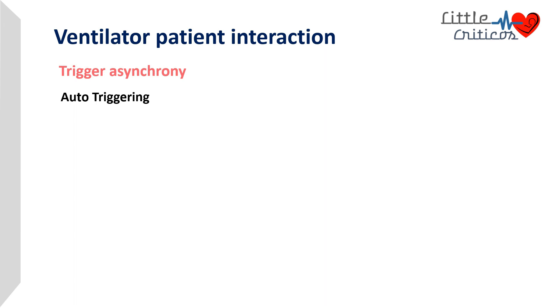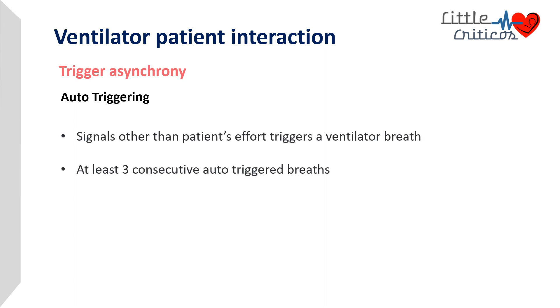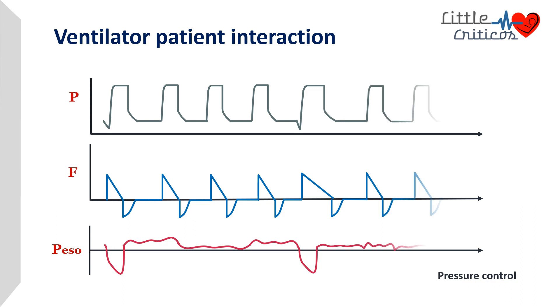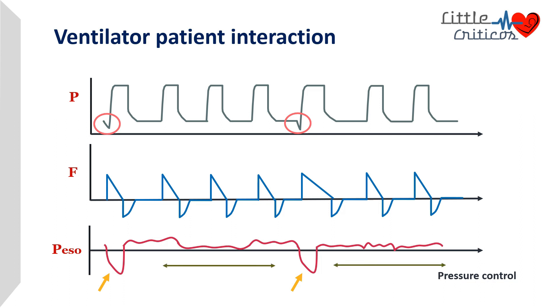Auto-triggering occurs when signals other than the patient's effort trigger a ventilator breath. In pressure-controlled mode of ventilation, after the first patient-triggered breath, there are three consecutive breaths not triggered by the patient, followed by a patient-triggered breath and then more auto-triggered breaths. Esophageal pressure changes are evident only in the first and fourth breaths; the remaining three breaths are auto-triggered.